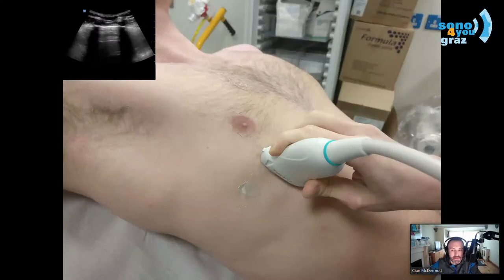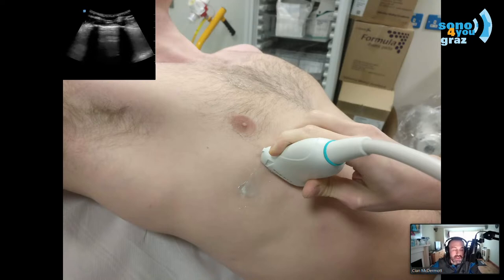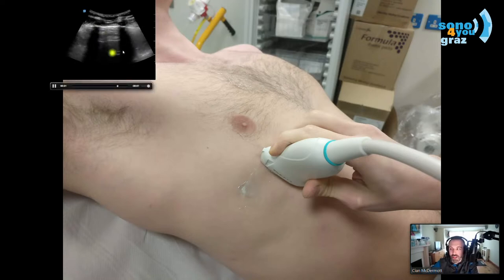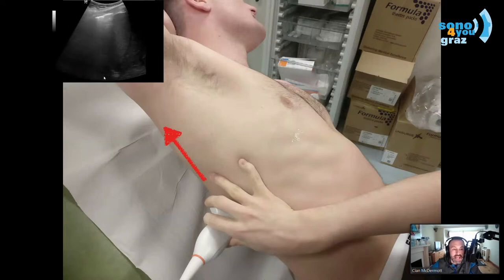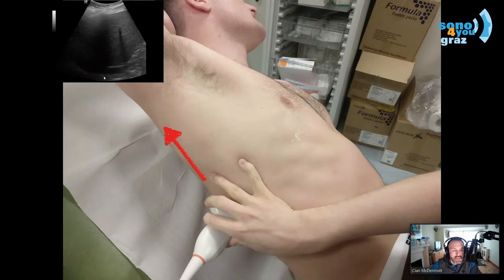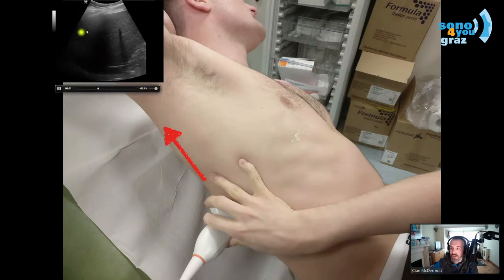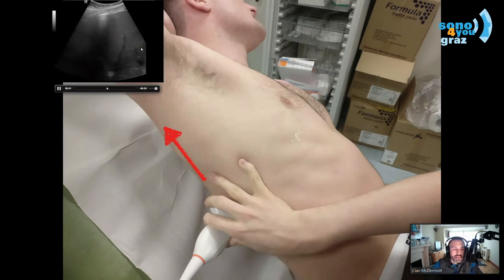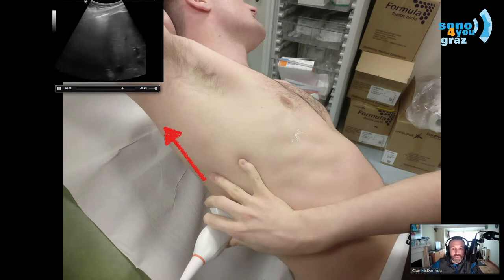Starting with the curved linear or linear probe on the anterior chest, hunt around in as many spaces as possible on both sides. You'll see a bright white pleural line at the top of the screen and two ribs on either side. Next, hunt around the lateral chest — place your probe and look at where you expect the diaphragm to be. The diaphragm is that big bright white line on screen, and you see a beautiful lung curtain coming across the field, which means you have air in the lungs.